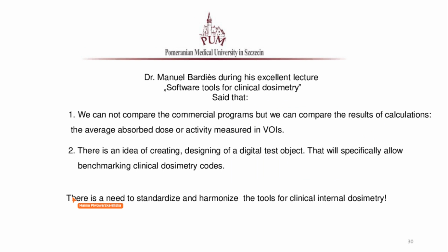We cannot compare the commercial software. Usually they are closed. Sometimes they are not described in detail, but we can compare the results of measures, that is the absorbed dose or the activity measured in the volume of interest. There's also an idea of developing a testing object, a digital testing object.